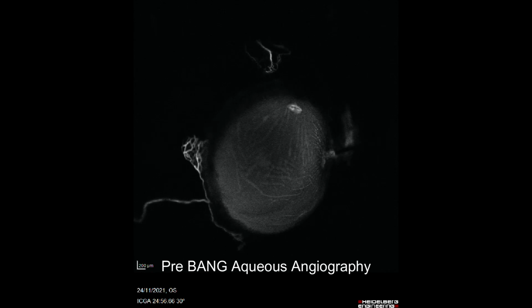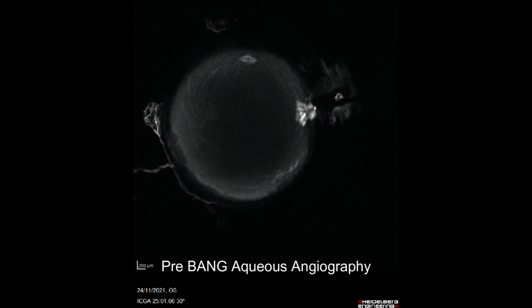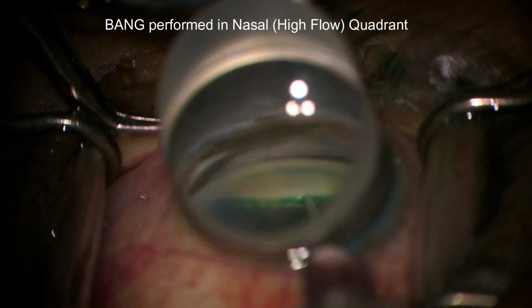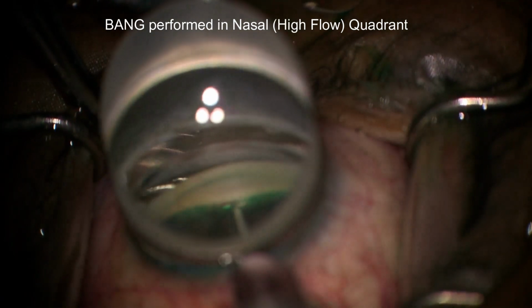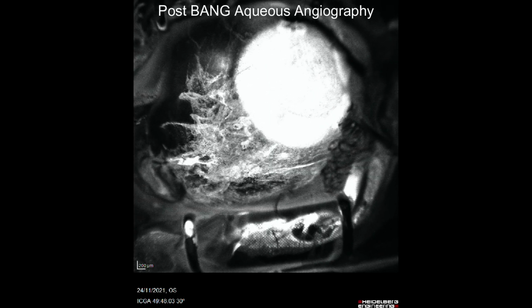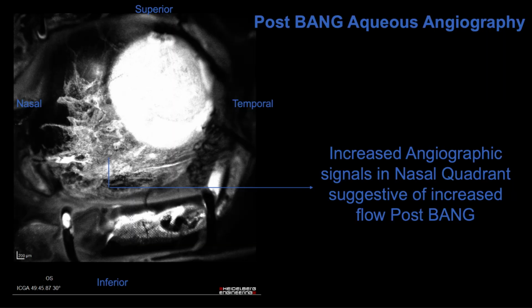Pre-Bang aqueous angiography showing high flow region in the nasal quadrant. Bang performed in the nasal quadrant, we can visualize the clear demarcation of trabecular meshwork due to green color staining by ICG dye. Post-Bang aqueous angiography showing increased angiographic signals in the nasal quadrant, suggestive of increased outflow post-Bang procedure.